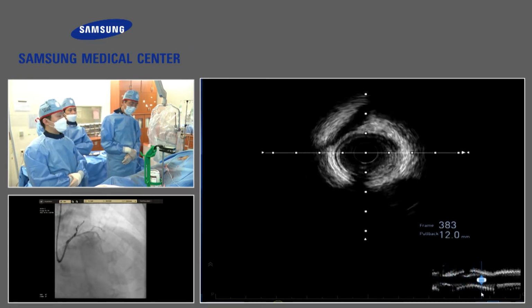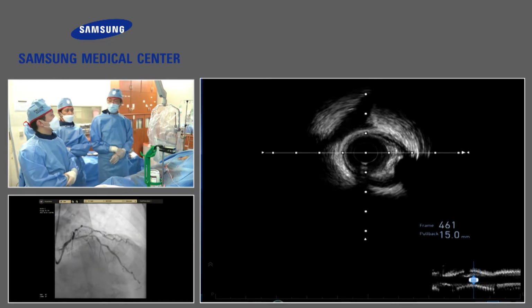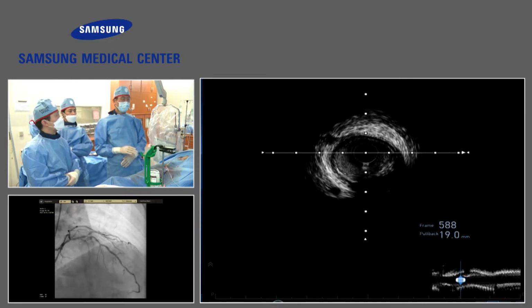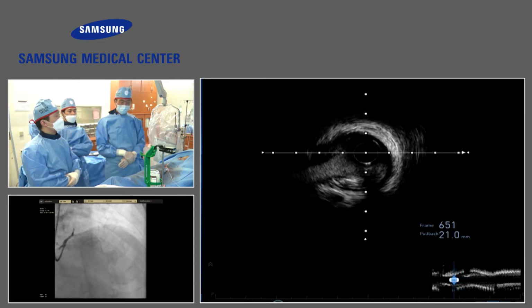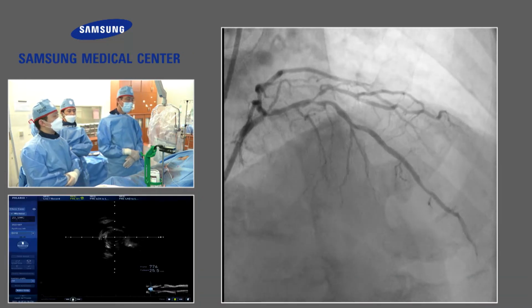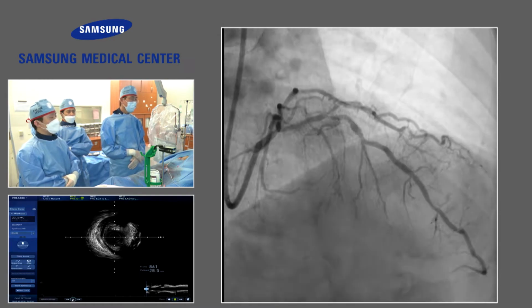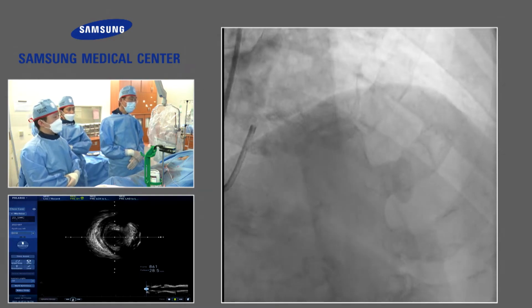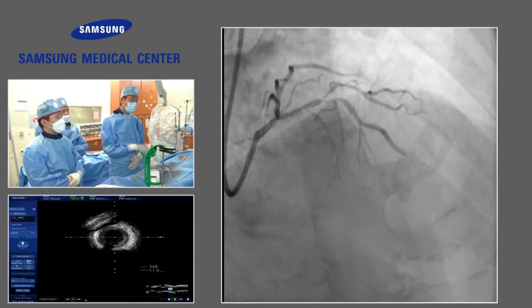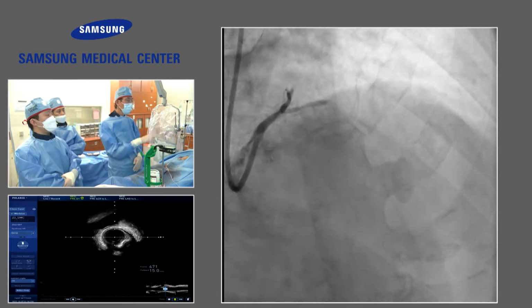So initially, angiographically, I decided on rotablation for LAD and possibly for circumflex. I would really like to show you how to perform the rotablator very easily within 5 to 6 minutes, but it's not good for this patient. I'd just like to show you how to treat the two bifurcations together. So actually, the next question I'd like to discuss is how to treat the two bifurcations.